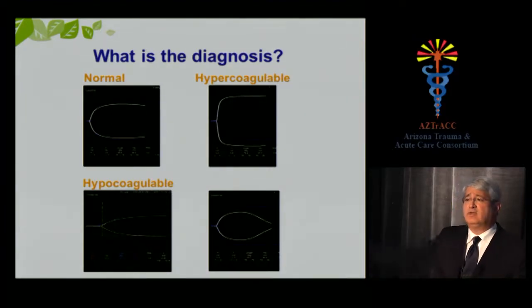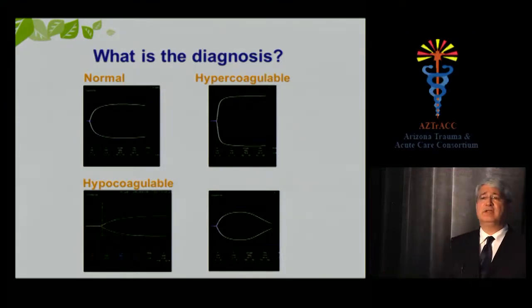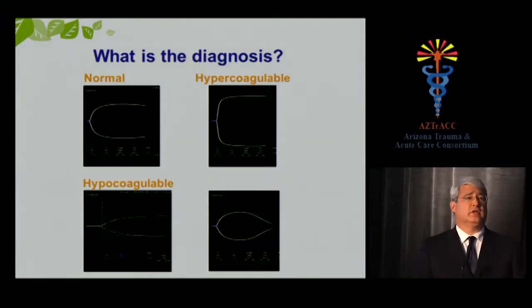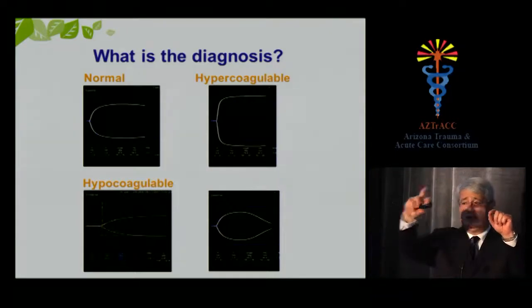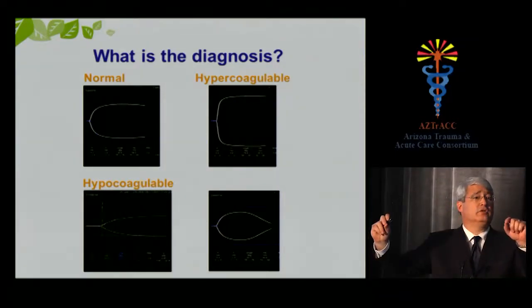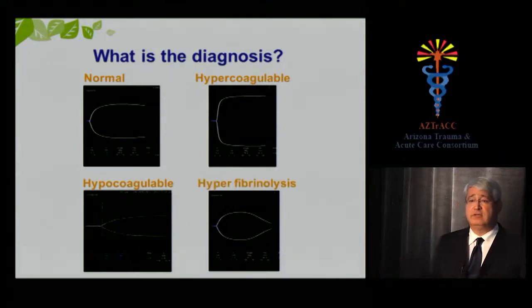Right? How about the last one here? That's a curveball. Excessive fibrinolysis. So this patient actually doesn't have a bad start. It goes clotting quite quickly. So this patient doesn't need plasma. And it forms a reasonable clot. But what happens is this clot is dissolved too fast. So this patient forms a clot, dissolves. Forms another clot, dissolves. Forms another clot, dissolves. What's going to happen? Soon, they're not going to have enough anymore to clot, and they're going to bleed nonstop. Okay? Right. Easy, huh?